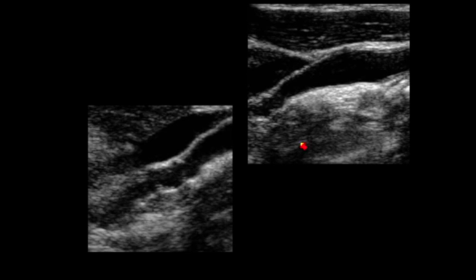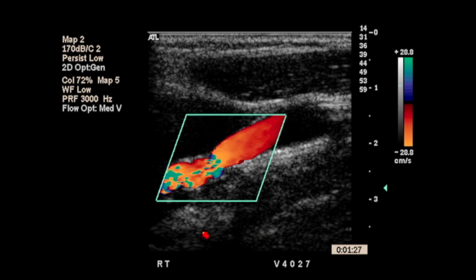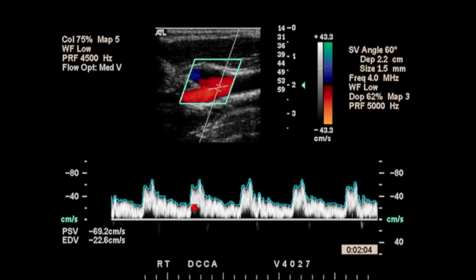So here's a patient. You can see the common carotid artery. Here's the carotid bulb, and the proximal internal carotid artery looks pretty good. And then as we get distally, it looks a little funky here. Here's a blow up of this vessel. Again, this is nowhere near the proximal internal carotid artery. And you can see these echogenic lines that are sitting inside of it. Those are associated with higher velocity. The vessel is straight, but there's aliasing here, which means that the velocity has gone up through that region.